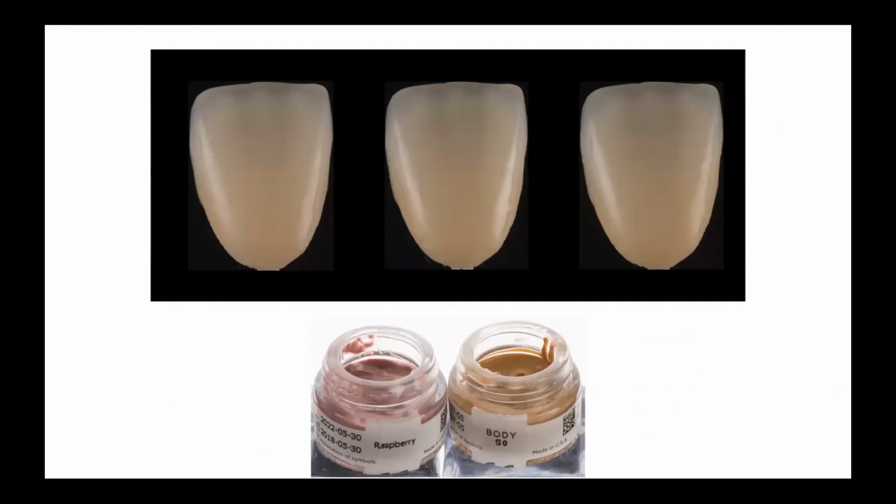Look at the cervical aspect of a natural tooth. We can find in this segment the presence of a chromatic orange shade due to a thin layer of enamel of the natural tooth, and at the same time there's the influence of the gingiva surrounding our restoration. So we can put our red stain to achieve good in vivo blending, good integration with our soft tissues, or we can put only orange stain to achieve more sufficient chromaticity. But if we mix these two components together, we will get the universal component, and the crown will look much better if we apply this mixture on the cervical aspect.